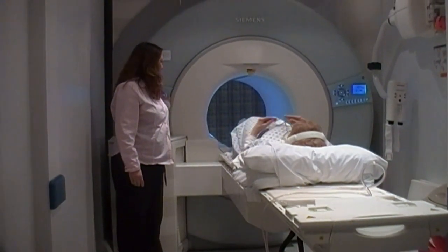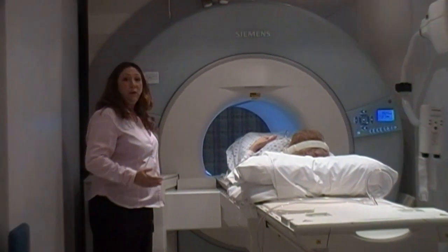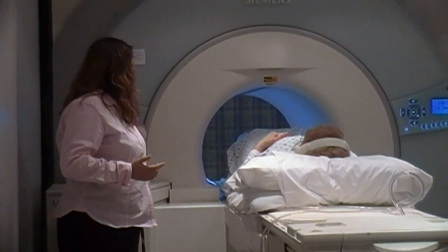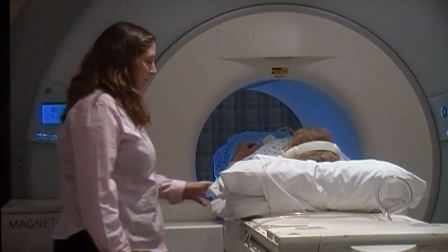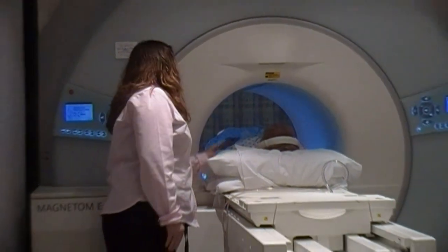We raise the table up. Whatever part that we're doing will be in the center. Usually this leaves the majority of your body outside of the scanner.